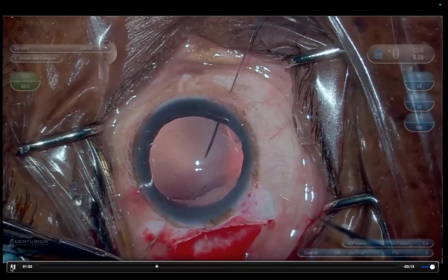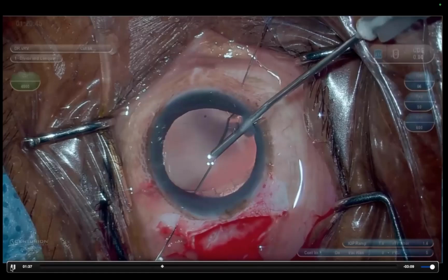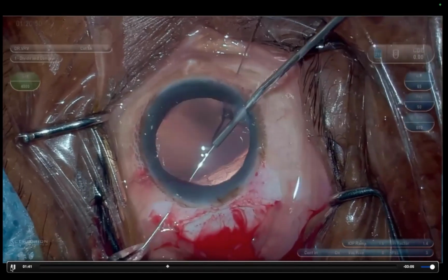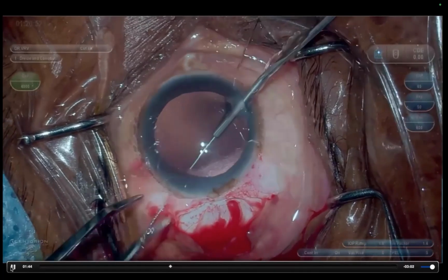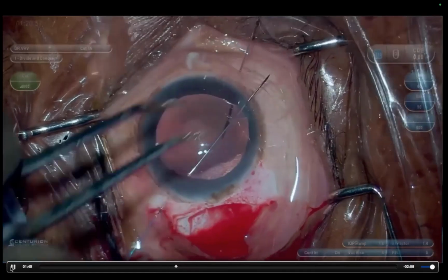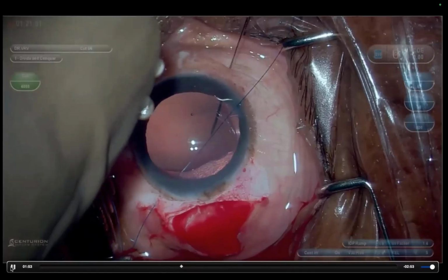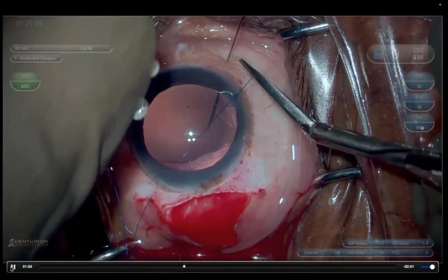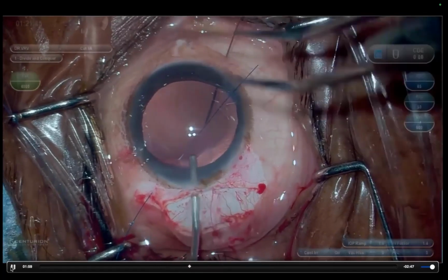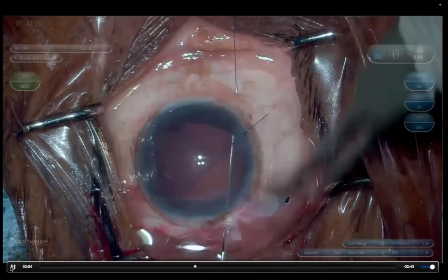So once both sclerotomies are done, the one that is close to the tunnel is externalized by making a paracentesis on the adjacent side. You dock, so this is a viscocannula attached to irrigation. So I dock the needle into that viscocannula and pull out the needle. Once the needle is pulled out, the needle is trimmed off. This is the internalization and externalization process of the needle. The one that is on the opposite side, you can directly dock in through the sclerocorneal tunnel.